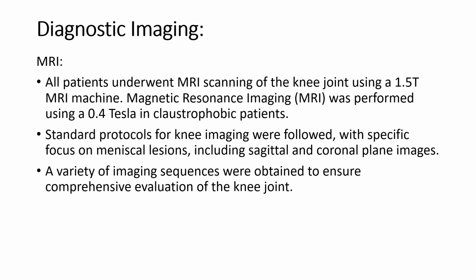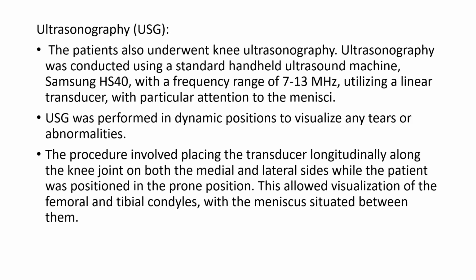After which, the patient underwent diagnostic imaging using 1.5 Tesla and 0.4 Tesla machines, and a standard protocol for knee imaging was performed with specific focus on meniscal lesions, including sagittal and coronal planes. A variety of imaging sequences were obtained to ensure comprehensive evaluation of the knee joint. And then USG was performed using a Samsung HS40 linear probe with a frequency range of 7 to 13 megahertz, with particular attention to the menisci.